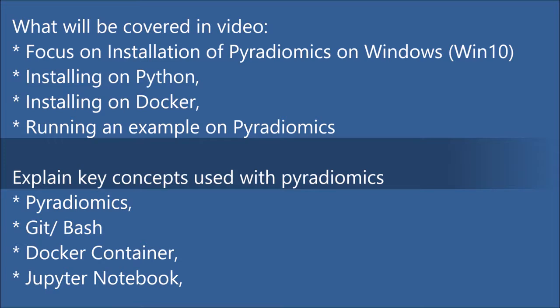I'll be covering installation on Python and on Docker container, and then finally once PyRadiomics has been installed we'll run a simple example. Along the way we'll be covering some key concepts that will be used with this PyRadiomics software.